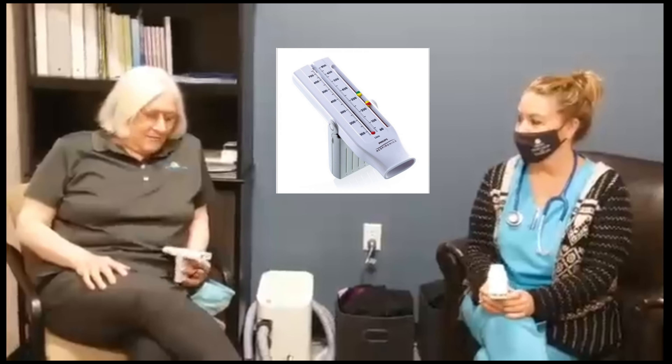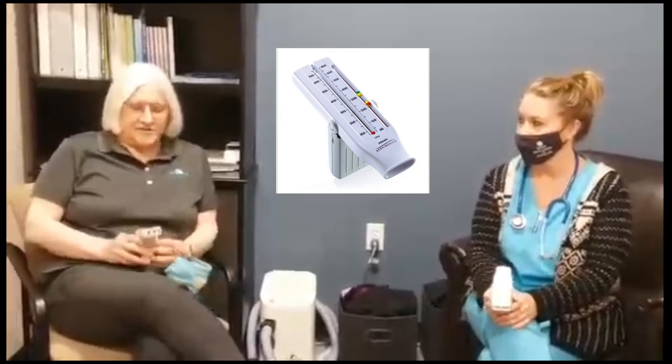Hi, this is Dawn here at Lifeline Therapy and Mary Ann Drevna from Breathe PA. We're respiratory therapists and it is Asthma Awareness Month. We are here today to teach you how to use a peak flow meter. The peak flow meter is going to help you understand when your lungs are starting to run into some difficulty breathing. It's a great tool to use to know whether you're going to need to take your bronchodilator or not.